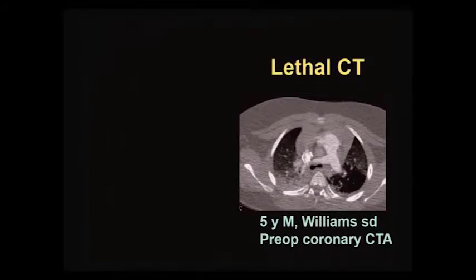And I'm sorry to say, but this was the only lethal CT that I've ever been involved with in my career, because the patient died within a few minutes after this acquisition of a cardiac arrest, despite being under the care of a cardiac anesthesiologist.